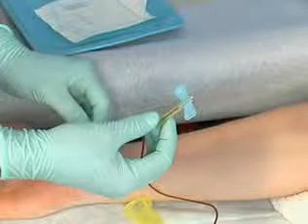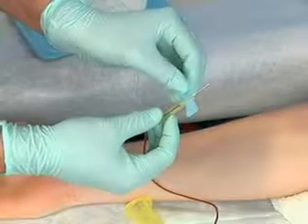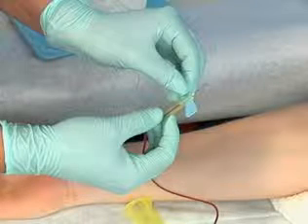To activate the safety shield, grasp the base of the shield with your thumb and index finger of one hand and grasp either wing with your other hand. Slide the wing back into the rear slot of the safety shield until you hear an audible click indicating the shield has locked into place.